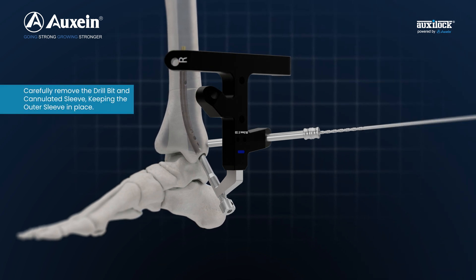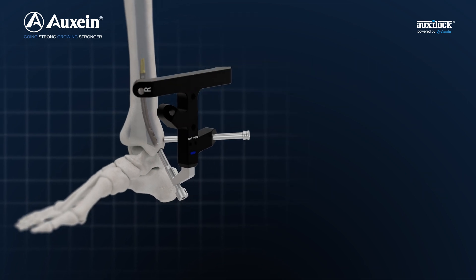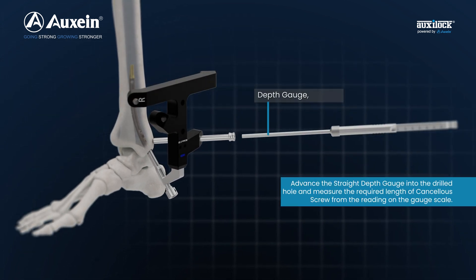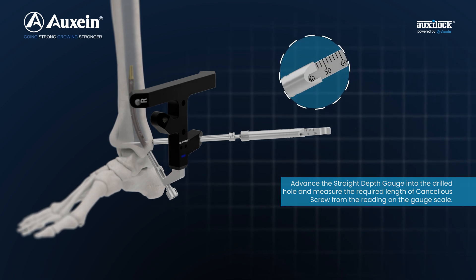Carefully remove the drill bit and cannulated sleeve, keeping the outer sleeve in place. Advance the straight depth gauge into the drilled hole and measure the required length of the locking screw from the reading on the gauge scale.